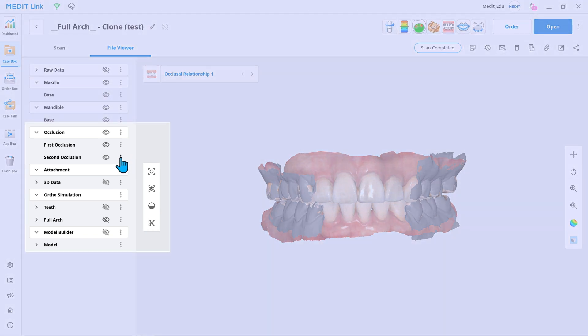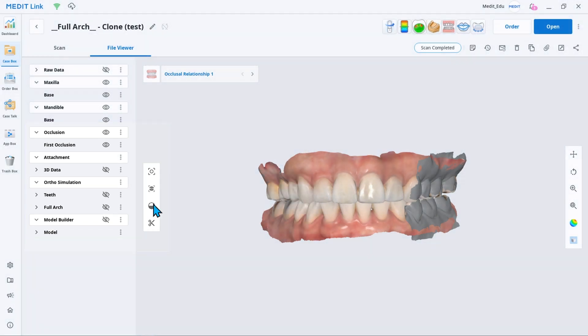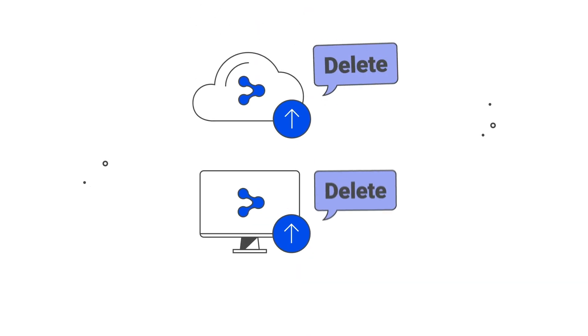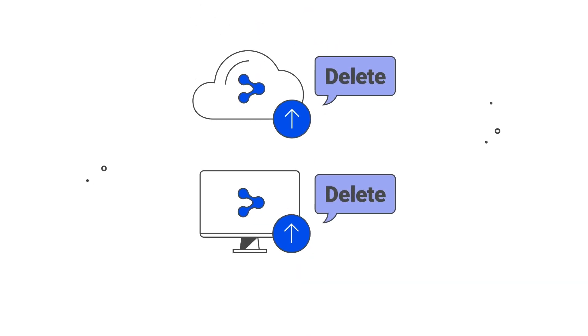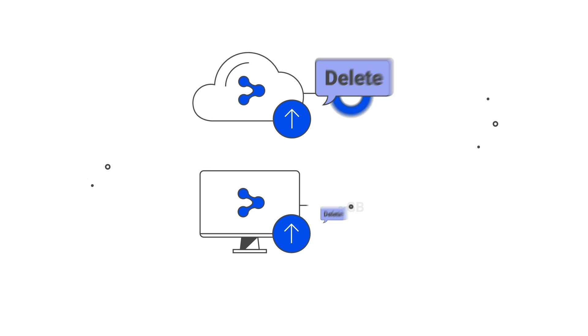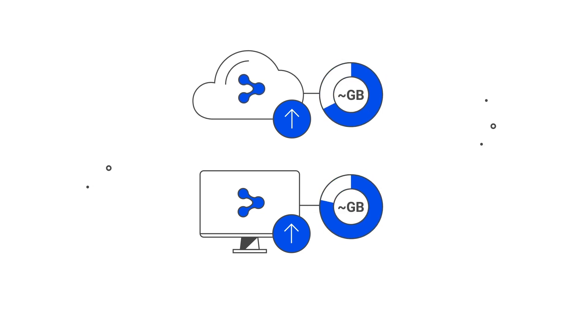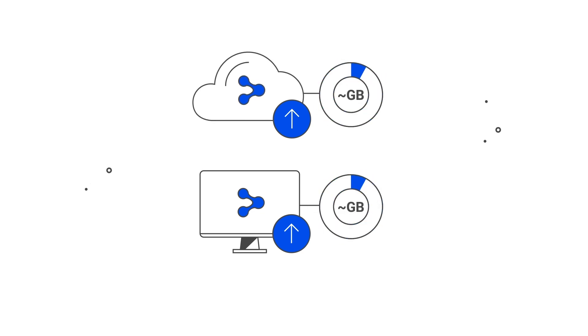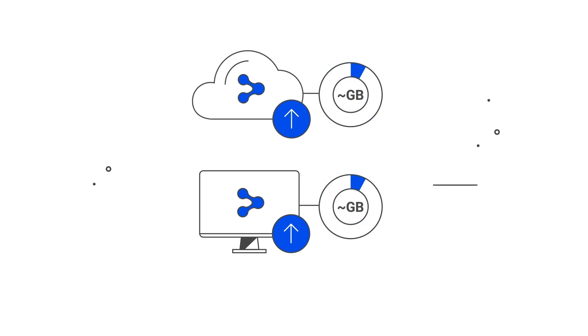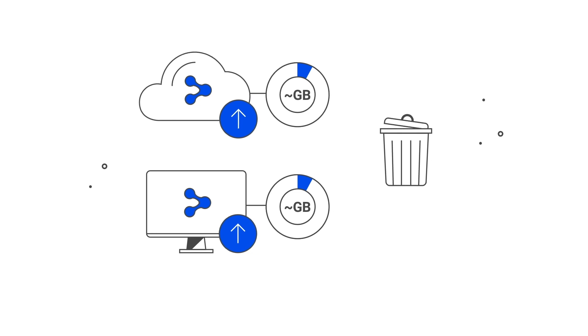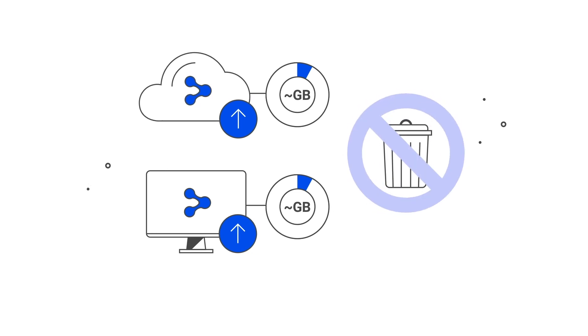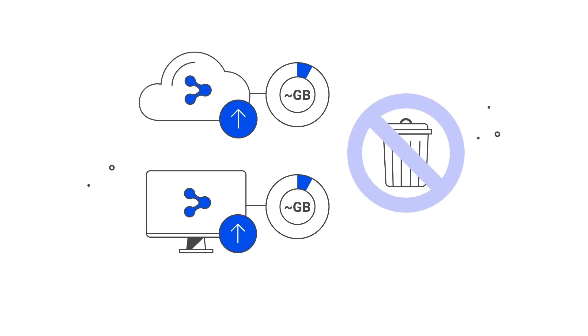The third option is to keep the case file but delete specific data parts from it. Open file viewer to select and delete separate data. This option deletes data from both the local and the cloud storage without transferring it to the trash box. Please note that you cannot restore data deleted this way.